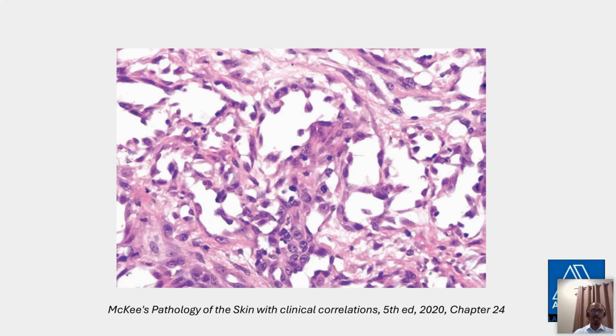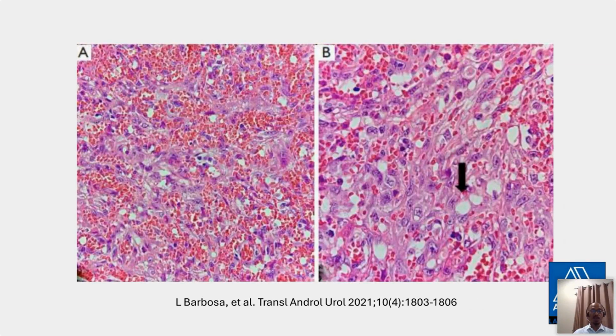And there's a little bit of hobnailing because of the enlarged nuclei. So the cells will be sticking out into the lumina of those vessel-like spaces. And in some cases, these vascular spaces are actually filled with erythrocytes, which then mimics an angiosarcoma even more closely. In this particular example, the lining cells were epithelioid, and it actually mimicked an epithelioid angiosarcoma.